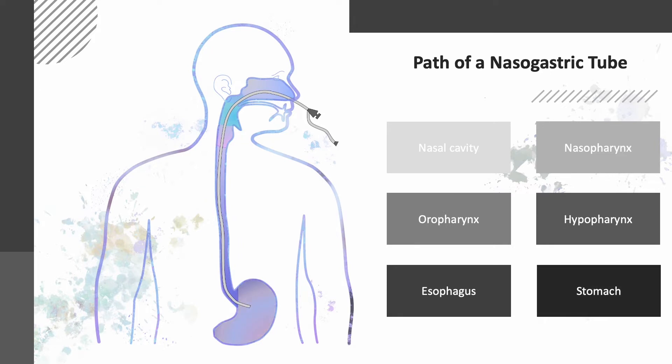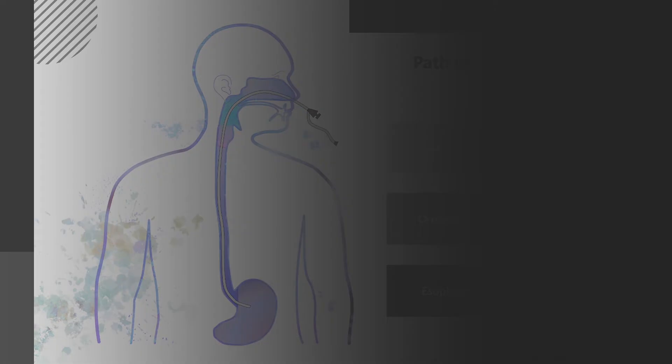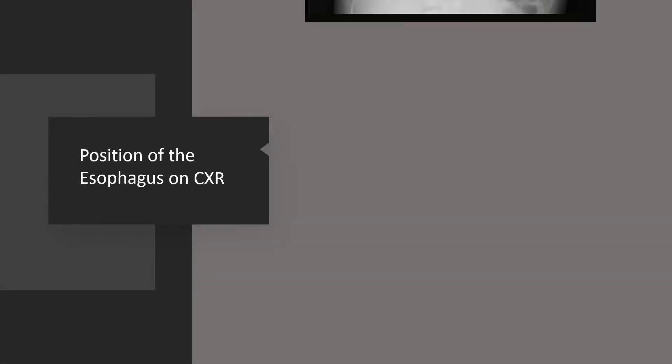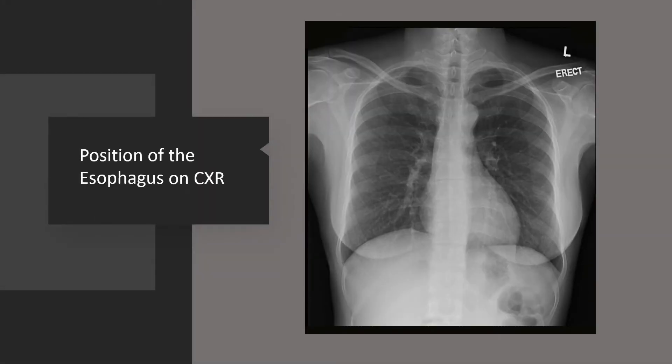A chest x-ray images the nasogastric tube as it passes vertically down the esophagus into the stomach. As the esophagus is not visible on a chest x-ray, it is essential to have an understanding of the normal anatomical position of the esophagus in relation to other visible structures to allow us to know where the nasogastric tube has been placed.